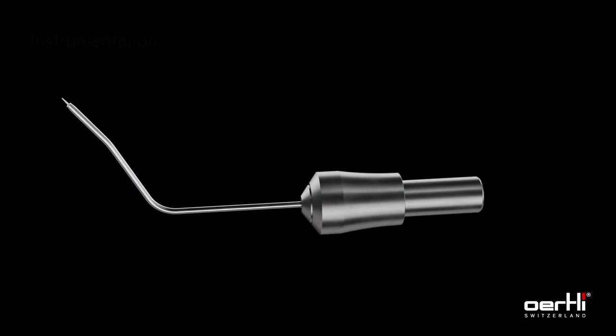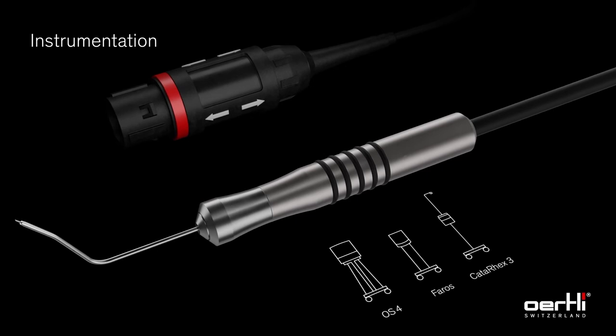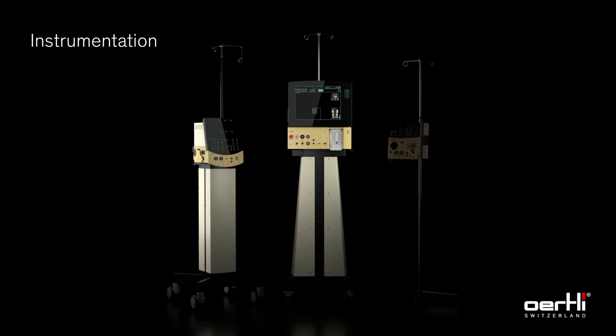The Oertli Diathermy Hand Piece, together with the specially formed HFDS tip, is connected to the Oertli Surgery Platform. HFDS can be performed with every Oertli Surgery Platform.